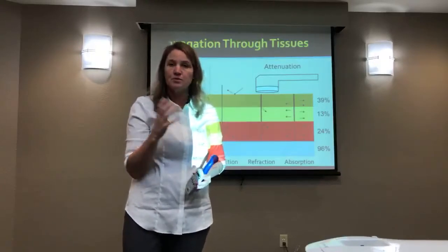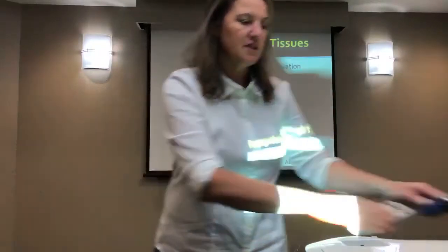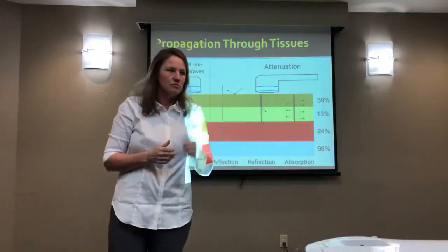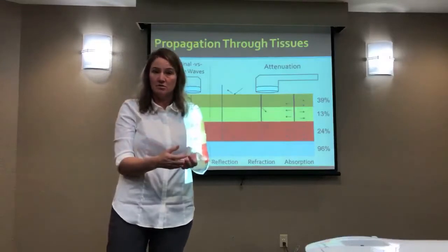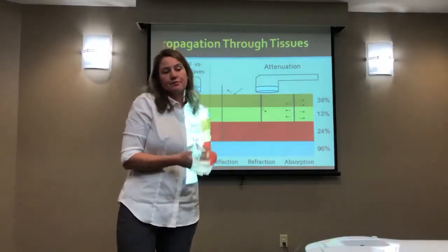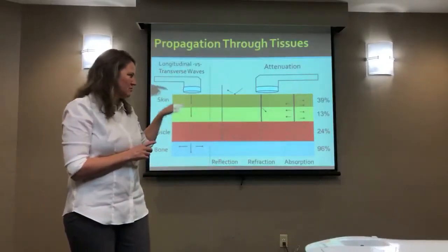But the absorption occurs, the more it penetrates, and the type of tissue and the bond it has with the tissue around it. So you know how all tissue is not created equal. The bond between two cells is different in your ligament and tendon versus your muscle versus your skin, and that's also going to affect how it penetrates and what it does to those cells, how much energy is absorbed. There was a study, this is actually an old study, I haven't seen a newer one done, so take it with a grain of salt in the fact that it was one particular study where they looked at skin versus fat versus muscle versus bone.